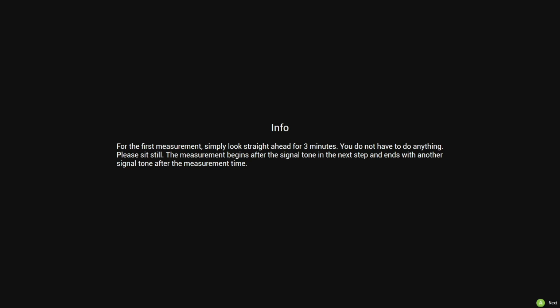You can customize everything. And this now says, okay, the next 3 minutes. So we're going to go through this flow now. You need to sit still and keep your eyes open. Now, what I'm going to do is I press A and hold it for 2 seconds. I'm pressing it right now. Now it makes a sound. You don't hear that sound, but it makes that sound. So it makes ding. Now his eyes open. Please keep your eyes open. And here, bottom right, you see a countdown. It's not 3 minutes, because we're not sitting here 3 minutes running a playback EEG.